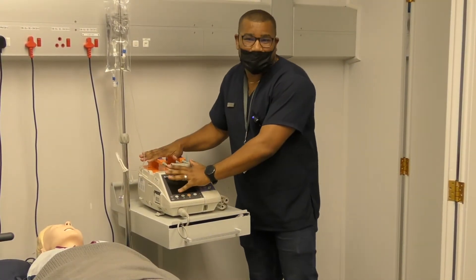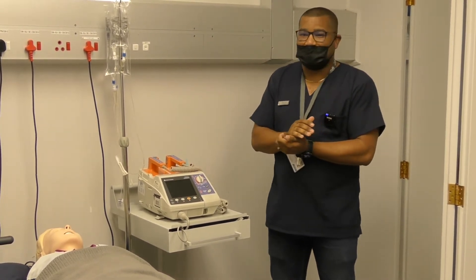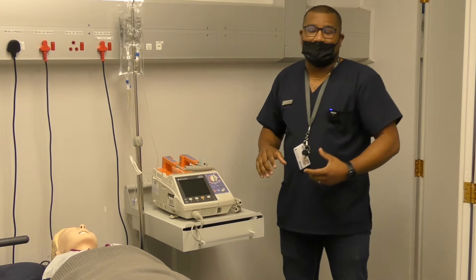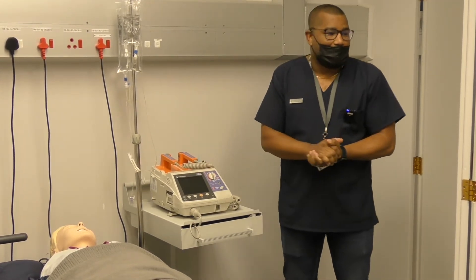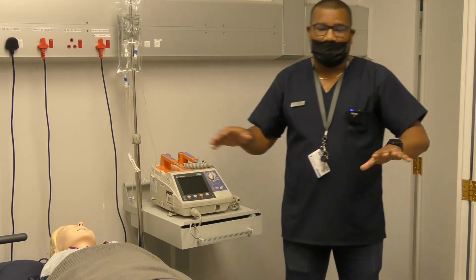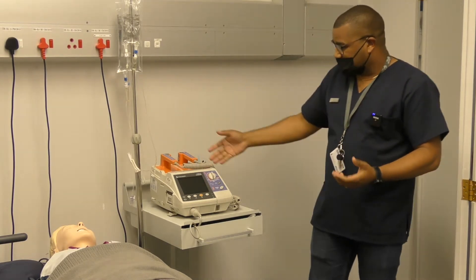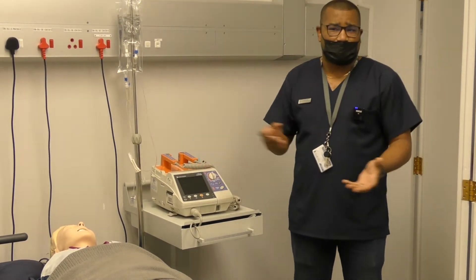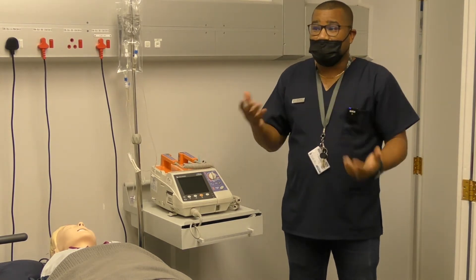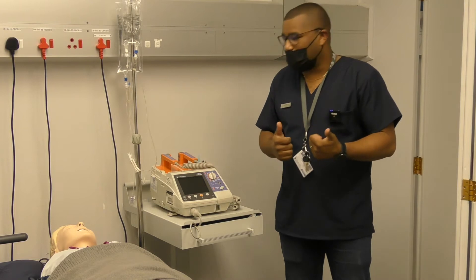Okay guys, you've requested a session on defibrillation. I thought it best to go through a step-by-step approach to familiarize yourself with the device first and see how we can use it. At first glance, before you do any OSCE preparation, it's key that you prepare your equipment. You'll see it's no different from any hospital setting where things that need to be on charge will be placed on charge, so that when you need to use it, it will be ready.